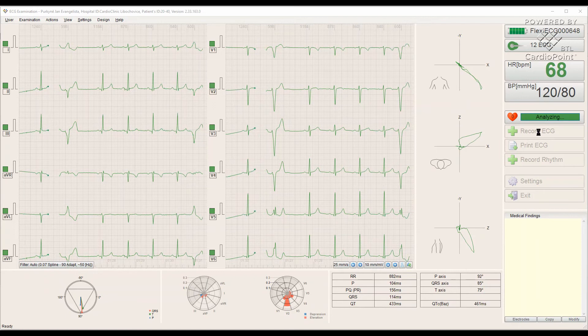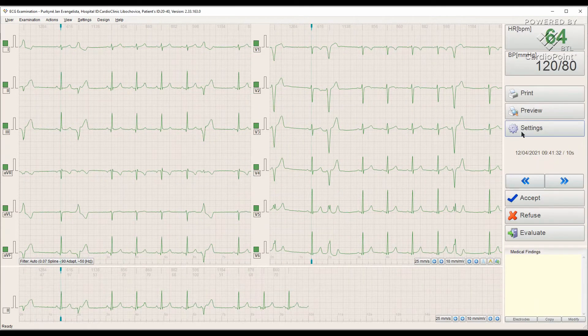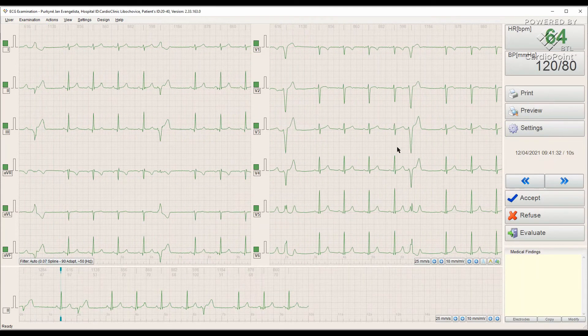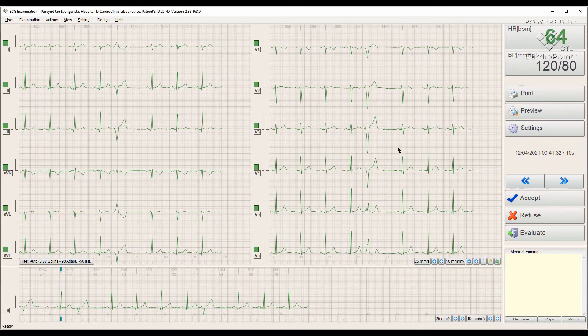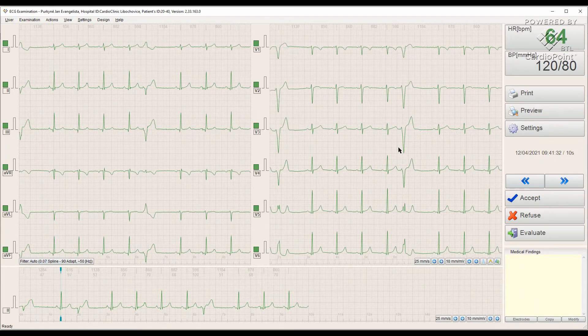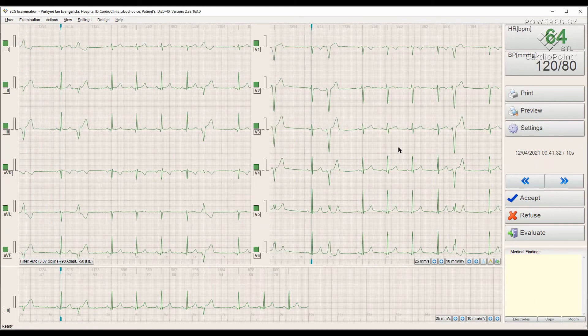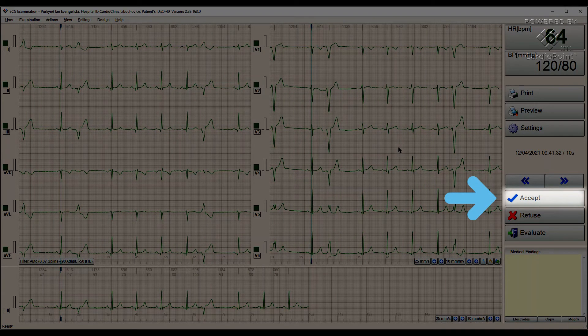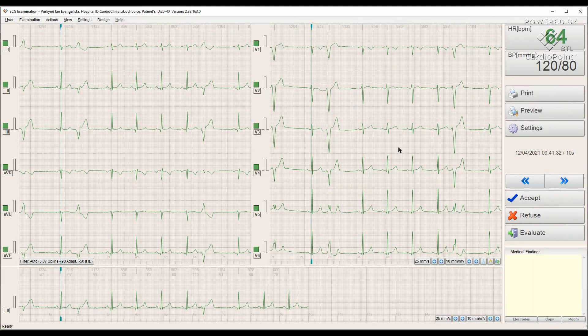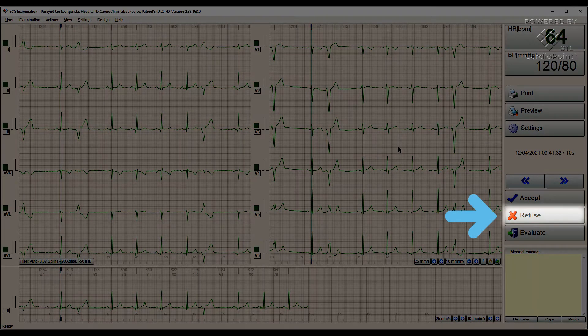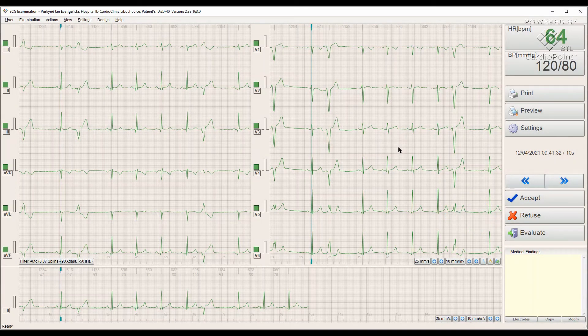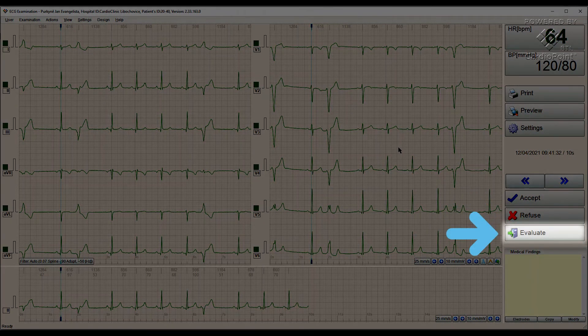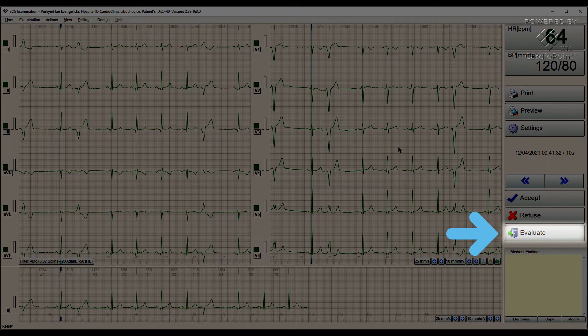When the recording is finished, a review screen appears and we can see three options to choose from. Clicking Accept saves the record and continues monitoring. Clicking Refuse discards the record and continues monitoring. And clicking Evaluate saves the record and switches the program to the Evaluation mode.